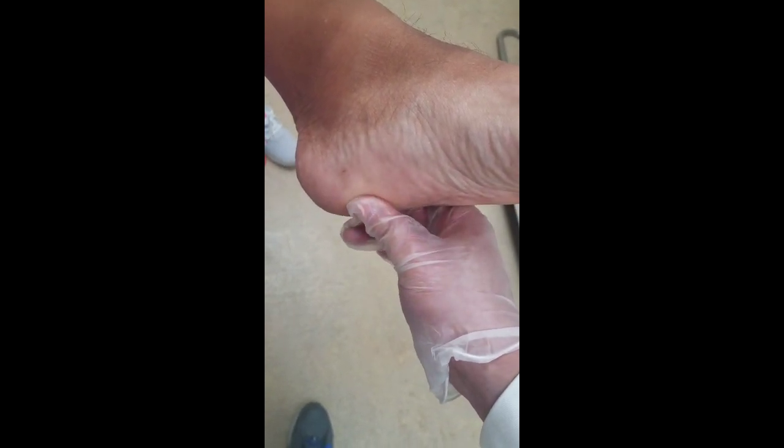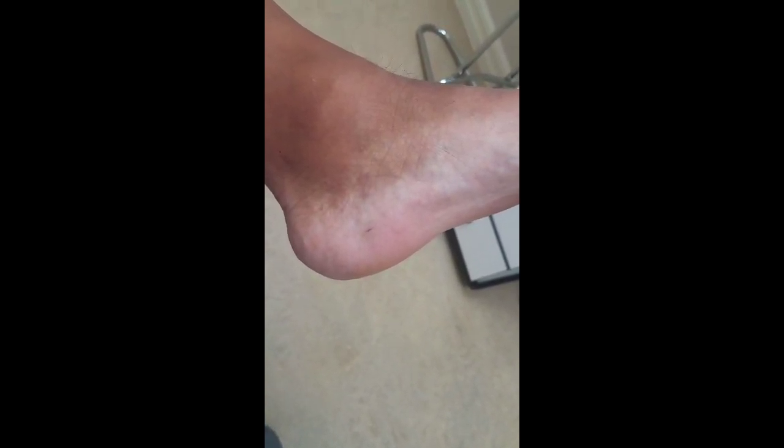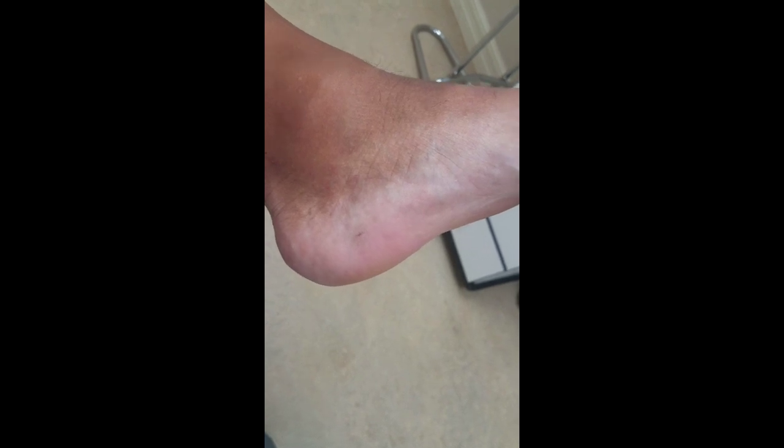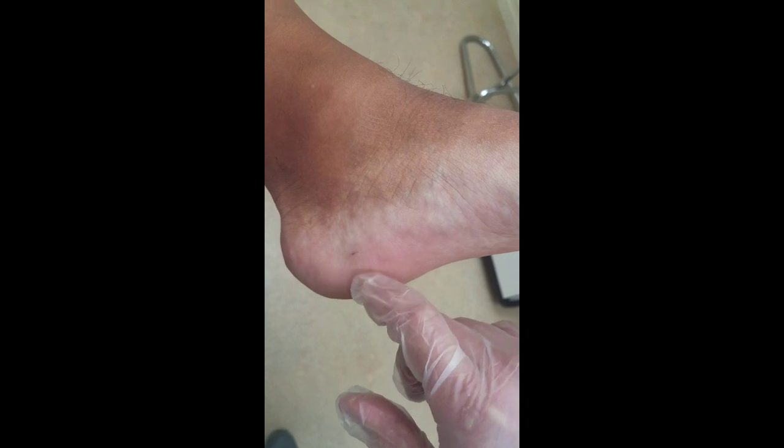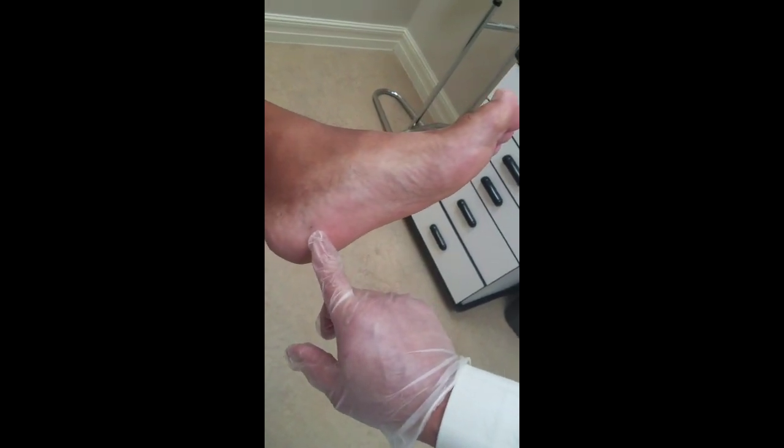How does it feel, let's say, before the procedure till now? Oh yeah, it was tight. It would have flare-ups. It would hurt. Now I think it's just a little sore from the actual procedure. Much better. Awesome. We'll just do a follow-up in 1 month and go from there. This was done under ultrasound guidance, and the incision is right there. We debrided the plantar fascia utilizing the TENJET. So far, so good. Everyone's done well.